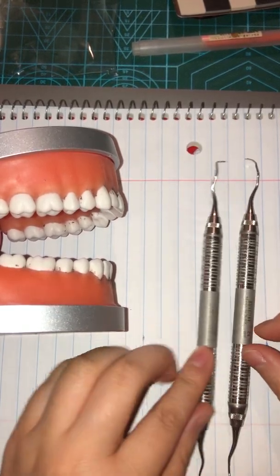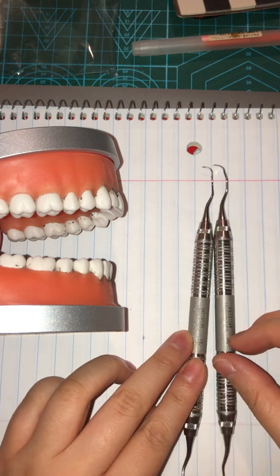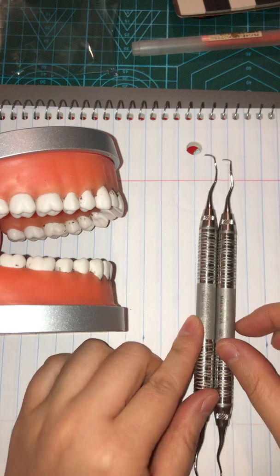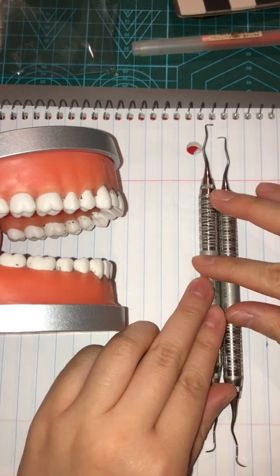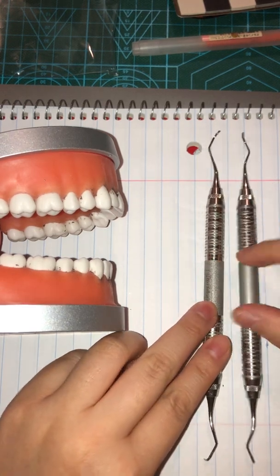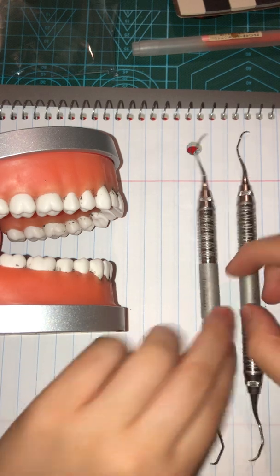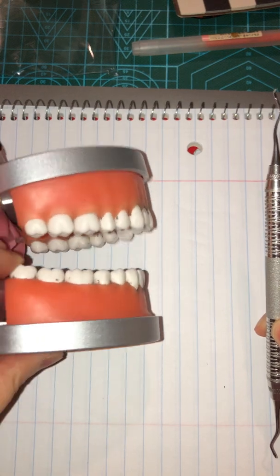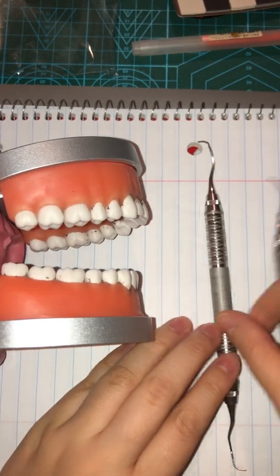For me, I have trouble figuring out the 13-14 versus the 15-16. So what I would do is I would obviously choose the side. Let's say I'm working on the mandibular right molars, right?